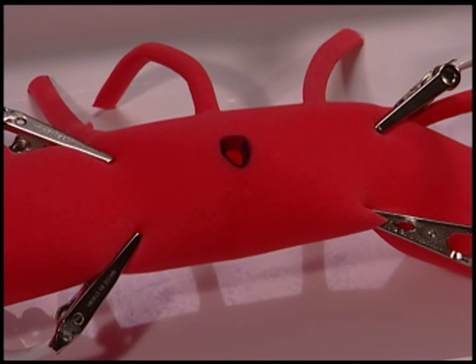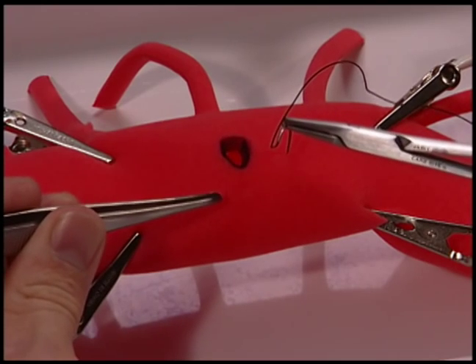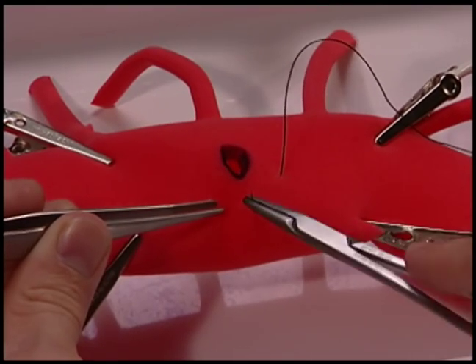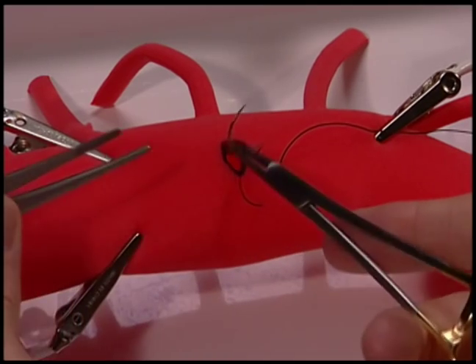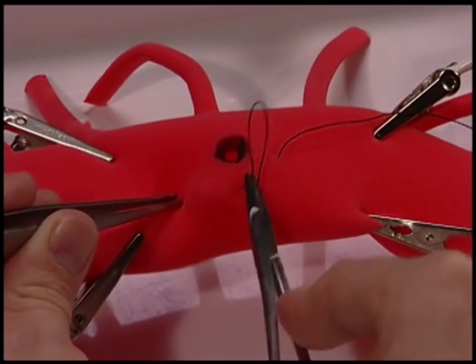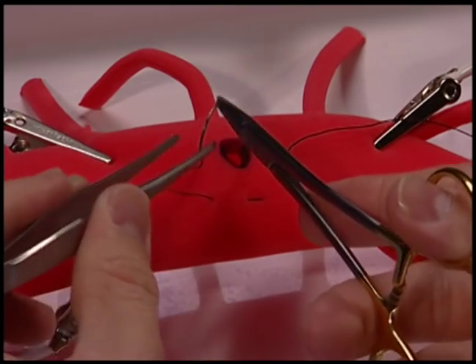A common error when performing a purse string suture is to start sewing towards yourself, although this is tempting. In fact, it makes the purse string closure much more difficult, because after the first bite or two, it forces you to sew backhanded for a much longer segment of the purse string, all the way up the left-hand side and across the back.